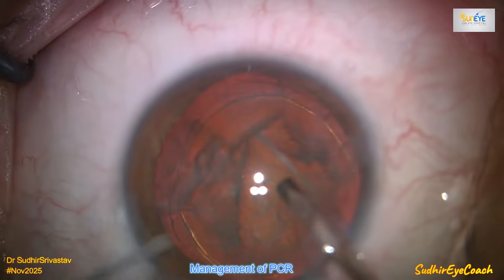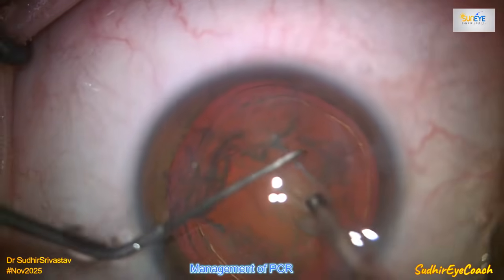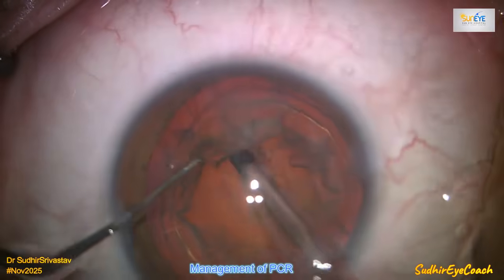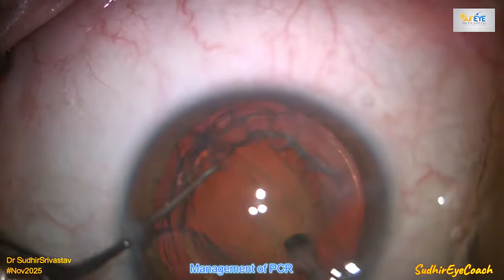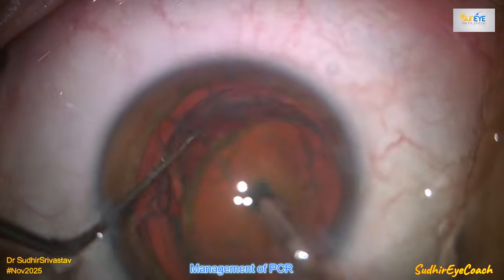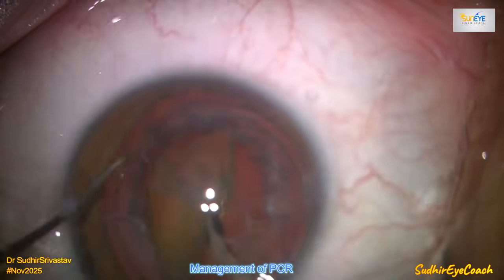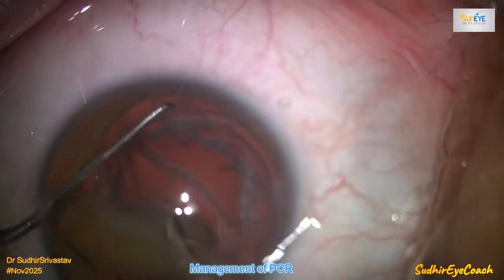Now I am ready to start the phaco fragmentation, and normally I use a Sinskey hook as a second instrument. Always remove the epinuclear plate over the nucleus, make the nucleus naked, and then whatever technique you are comfortable with, you can start phaco fragmentation.